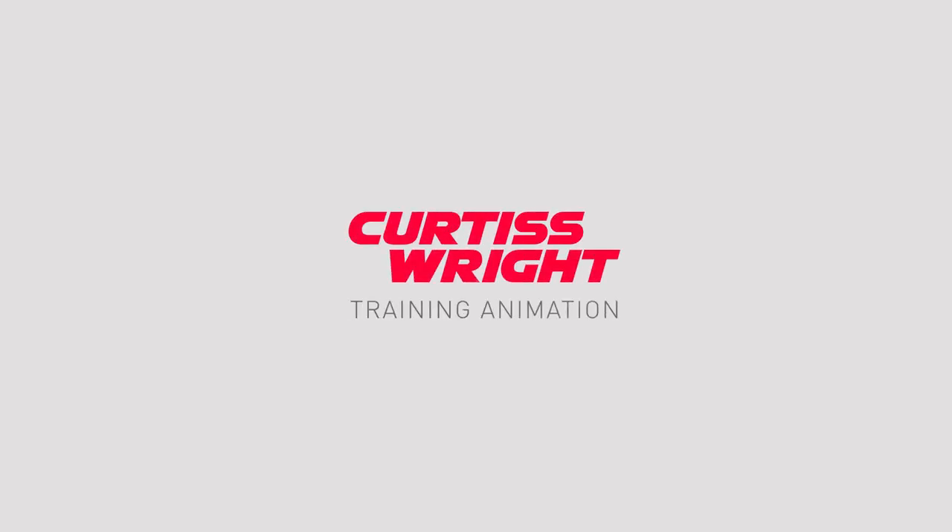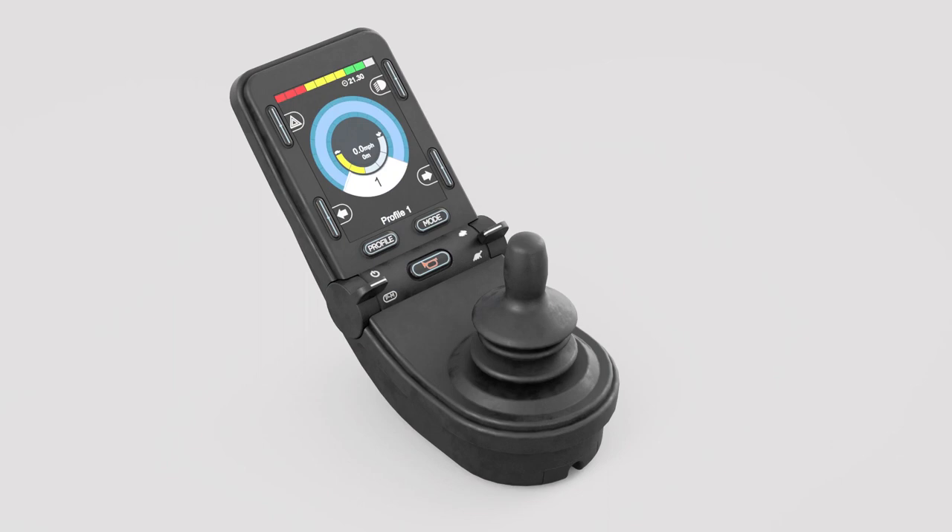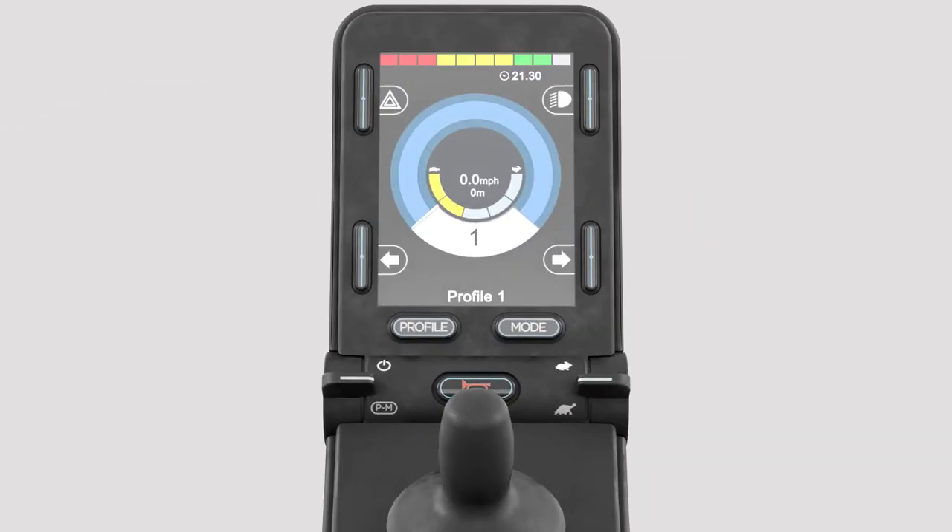The following is a training video to assist with pairing the R-Net Bluetooth with an Apple iOS device. Ensure the R-Net system is switched on and the Apple iOS device has Bluetooth enabled.